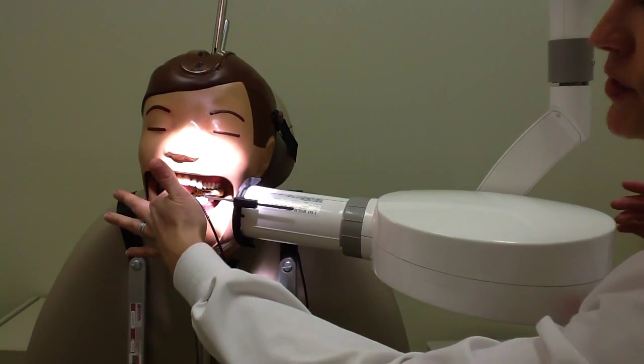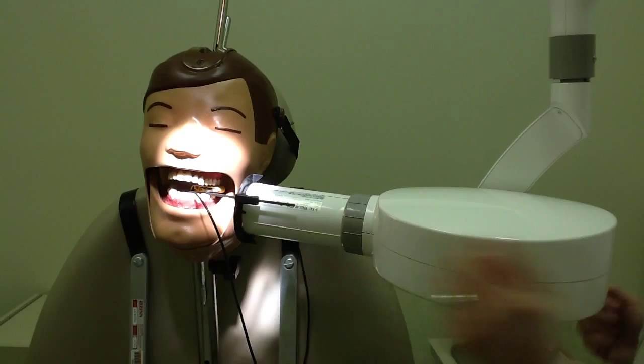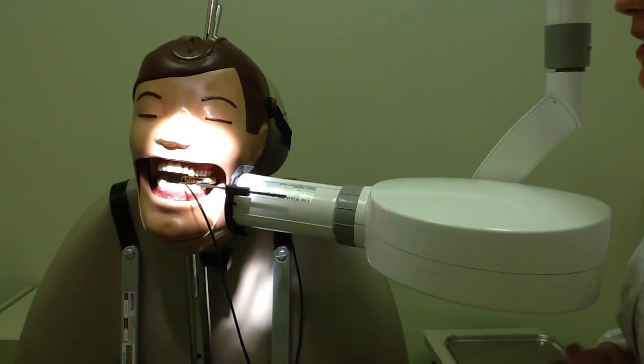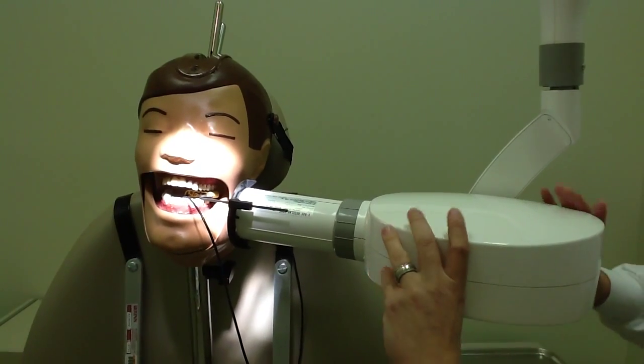We have a receptor parallel to the tooth long axis, which is parallel to the ring here and our PID. And this will shoot our central ray right through the teeth. Again, because we've centered the tooth, we won't miss any of the anatomy.